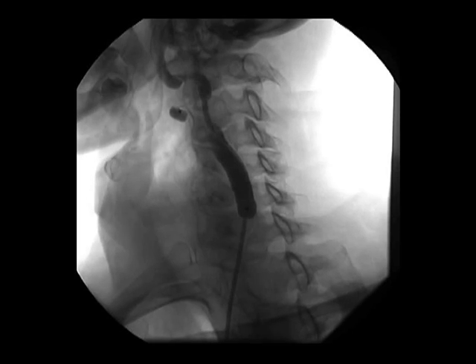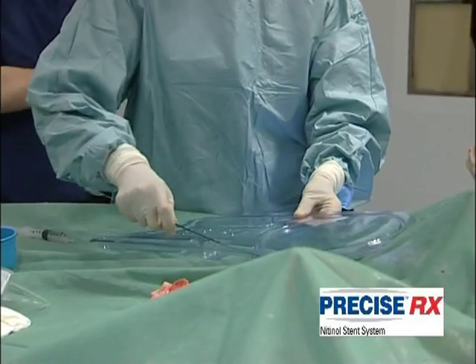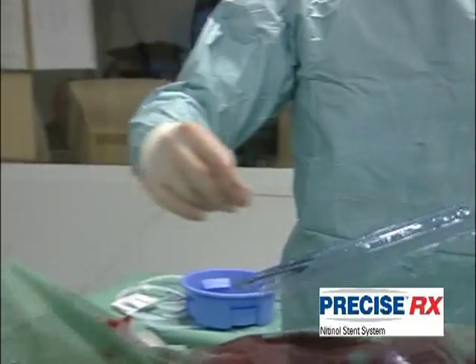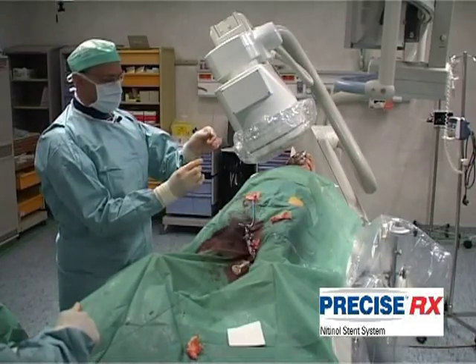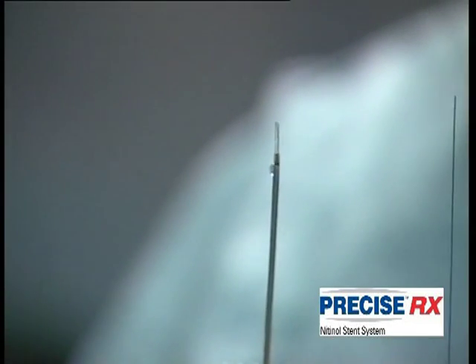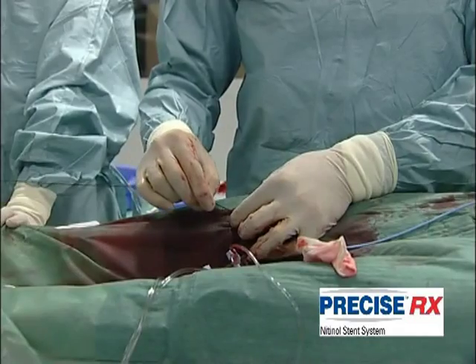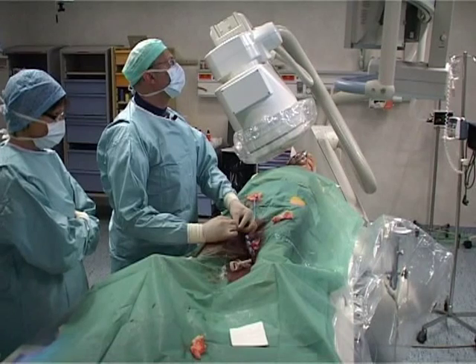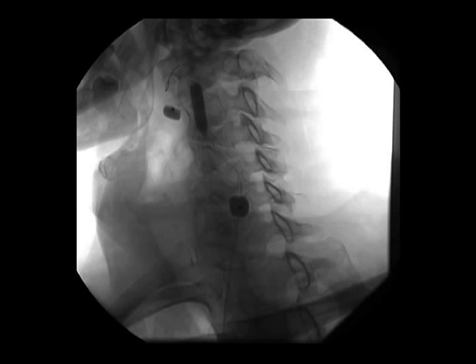predilatation, preparing the precise stent 8/40 millimeter, chasing the bubbles. Okay. Placing the precise stent, post-dilatation.